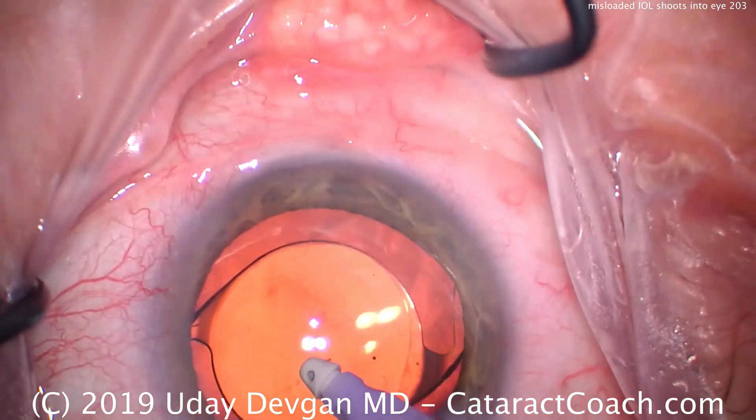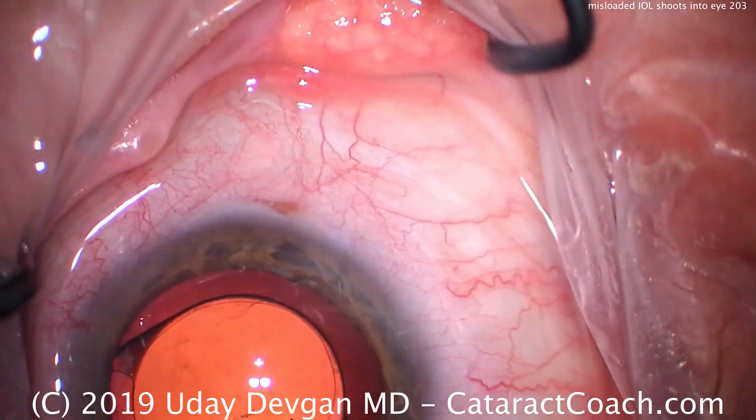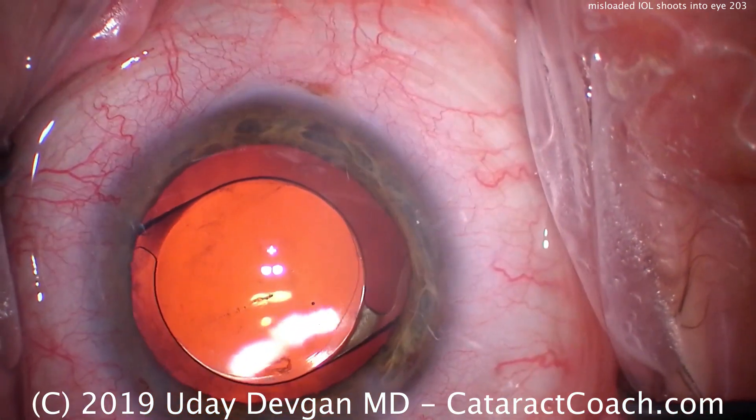And that happened as it got forced down the barrel of the injector tip. So again, carefully moving viscoelastic — we'll try to go under that IOL and remove that. But I'm pretty sure that opacity is within the lens itself.